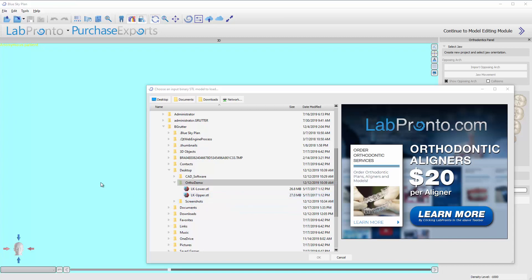Okay, so we are now in the orthodontic module. For this step we're going to just open up our case. You're going to find wherever your models are. So in this case I've got it on my desktop under orthodemo. I'm going to click on the upper model.